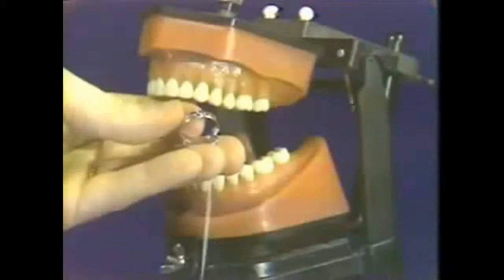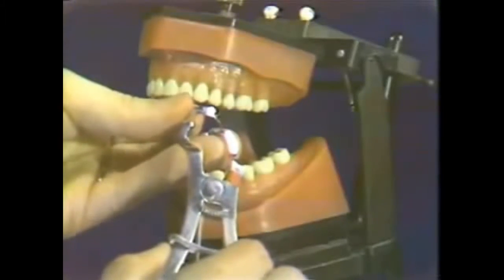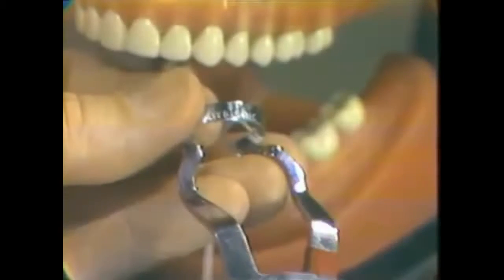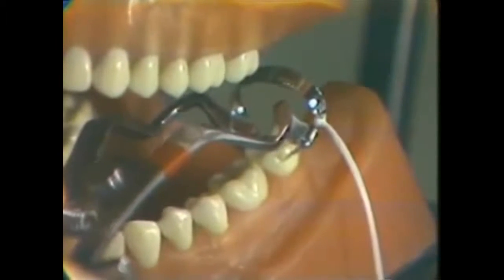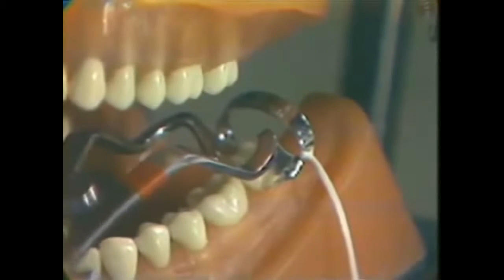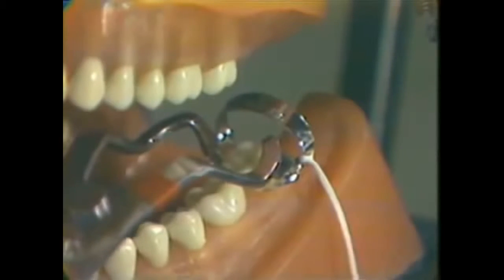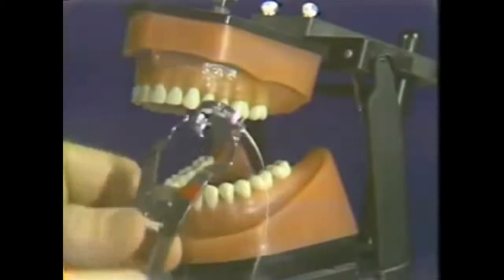Now, engaging the apertures of the clamp jaws with the clamp forceps so that the clamp can be expanded and carried to the second molar tooth. Then this will be placed over the tooth, first with the lingual and then tipping toward the buccal. Now, the testing there reveals that the clamp is stable. After the pre-testing, the clamp is again removed for later placement.